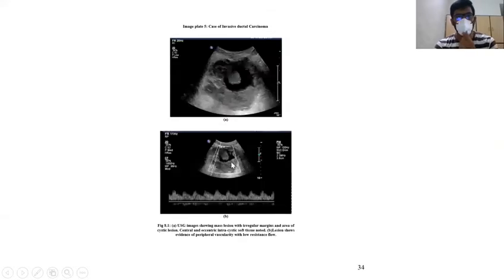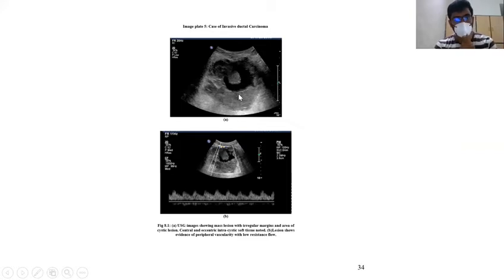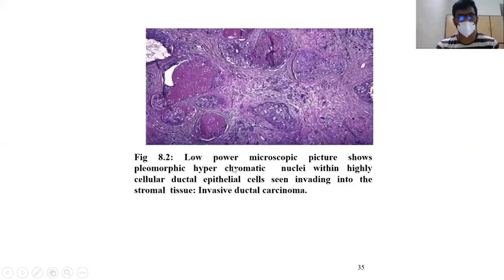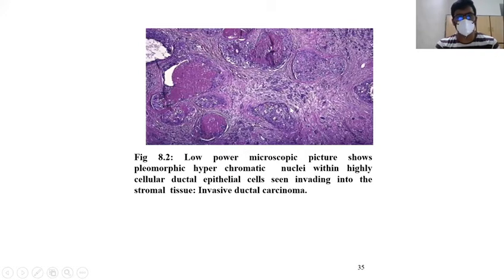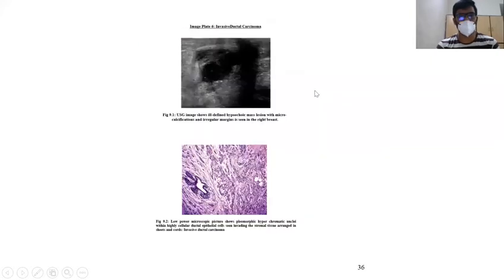This is the case of invasive ductal carcinoma. Here we can see a mass lesion with irregular margins and an area of cystic change. Central and eccentric intracystic soft tissues are noted. The sonogram demonstrates peripheral vascularity with low resistance flow. The histopathological picture shows pleomorphic hyperchromatic nuclei within highly cellular ductal epithelial cells seen invading into stromal tissue, consistent with invasive ductal carcinoma.